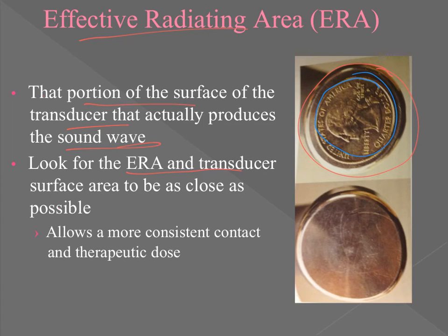So why is that important? Because if we make the assumption that our entire head is emitting ultrasonic energy, then that's a terrible assumption to make, because we'll treat a larger treatment area than the ultrasound head is capable of treating. Are you tracking with me here? In other words, always make the assumption that less of the ultrasound head is emitting ultrasonic energy, so that you'll break up your segments into smaller pieces to ensure that each piece is getting ultrasonic energy and is able to be treated the way that you need it to be treated. Are you tracking there?